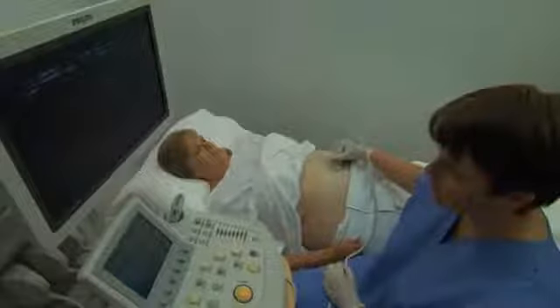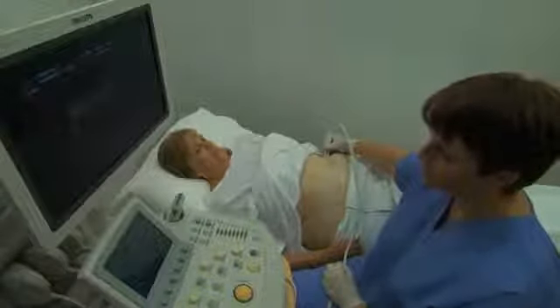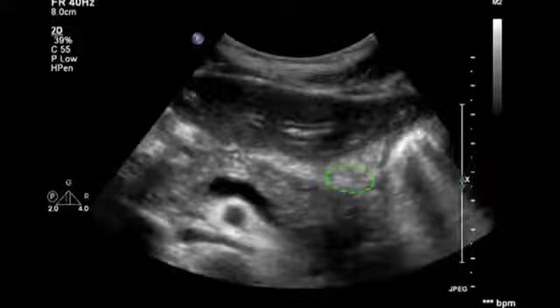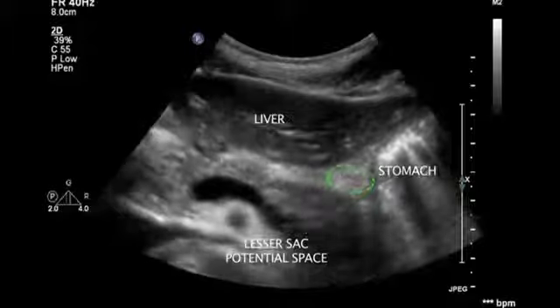There are two main regions of the peritoneum, the greater sac and the lesser sac. Identify any fluid lying in the lesser sac by scanning to the left of midline from midliver down to iliac crest. If fluid is seen in the lesser sac, measure the collection in 3 dimensions.